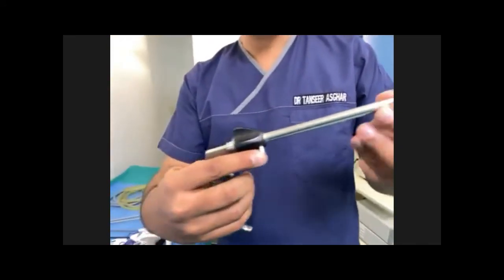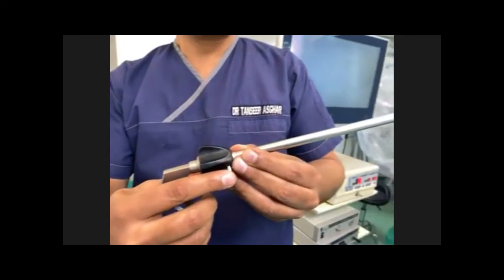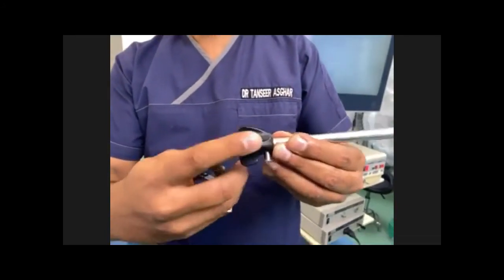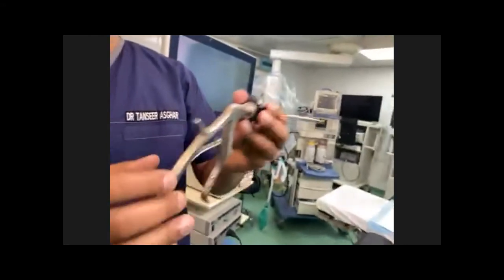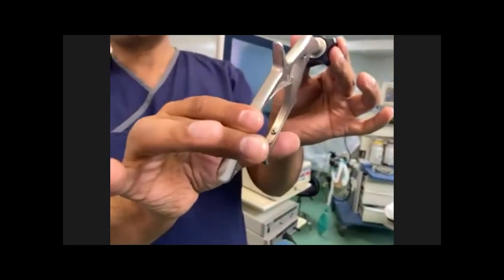This is the shaft of the instrument, and this is the knob where you can rotate it. Here, this is the handle for pressing it.